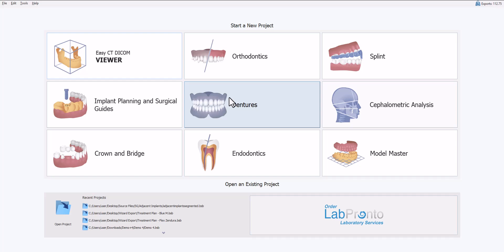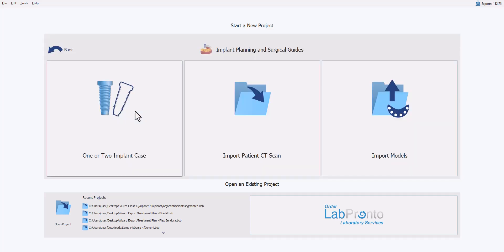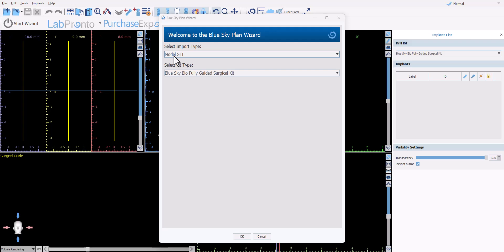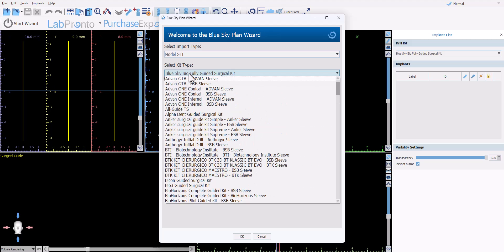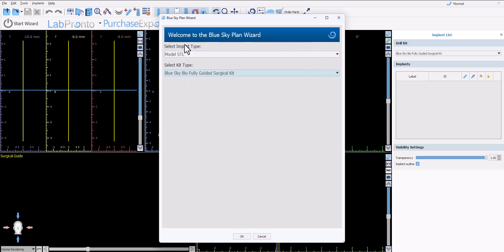We are going to start the wizard flow by going to Implant and Surgical Guides, selecting one or two implant case. The software is confirming the data set that will be imported. We strongly recommend the use of a model STL or an intraoral scan and the BlueSky Bio fully guided surgical kit. If you're not using BlueSky Bio implants you could left click and select from a long list of other surgical kits. Make the correct selection and then choose OK.